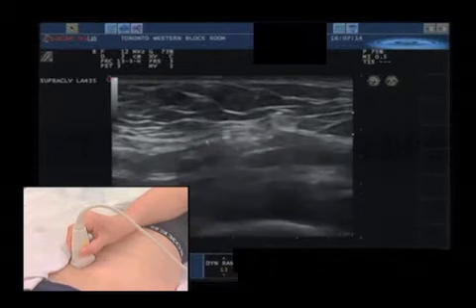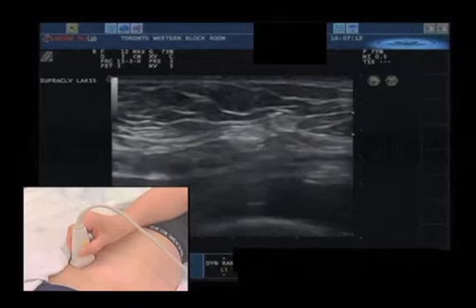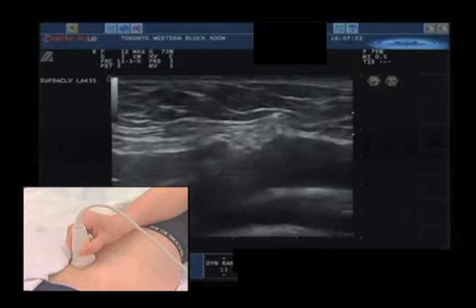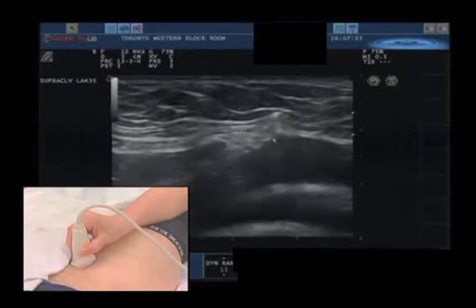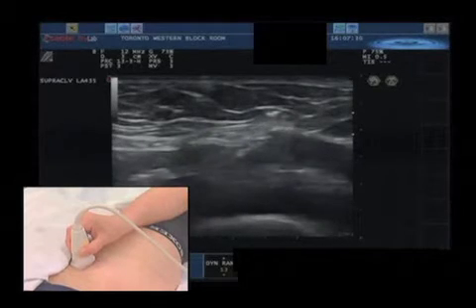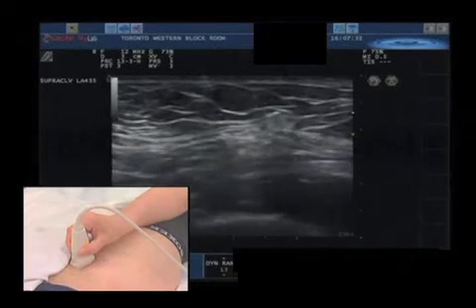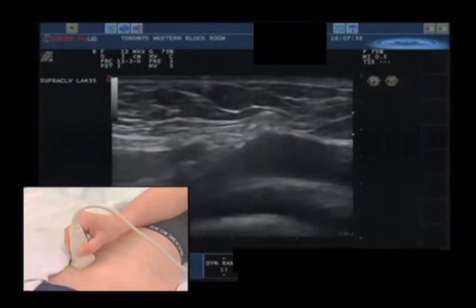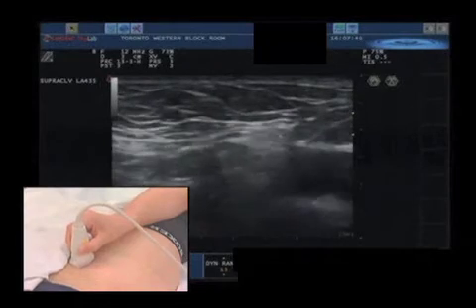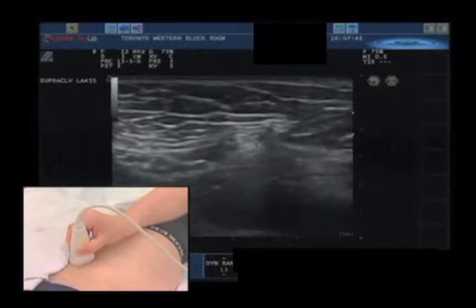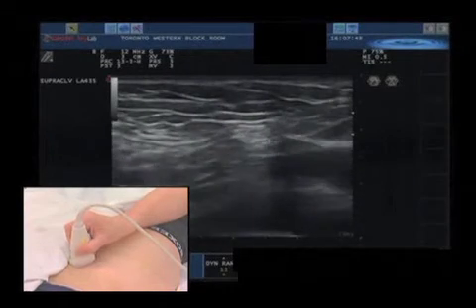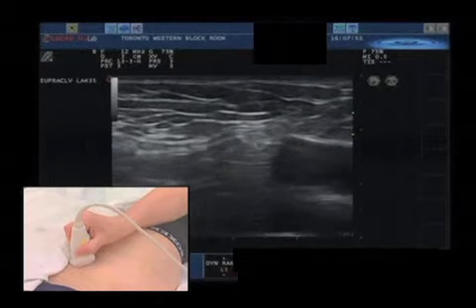The spermatic cord is an ovally shaped structure, and in almost all cases it has an inferior, brighter reflex border which is continuous with the inguinal ligament. If we move the transducer more medially and orient it more obliquely according to the course of the spermatic cord, we are even able to identify layers within the spermatic cord.